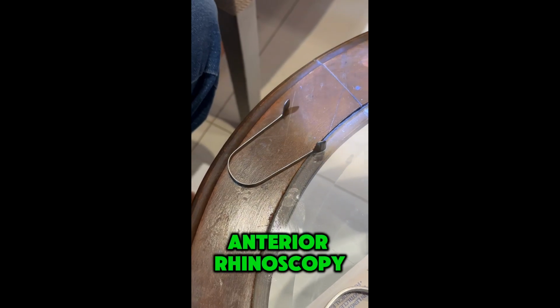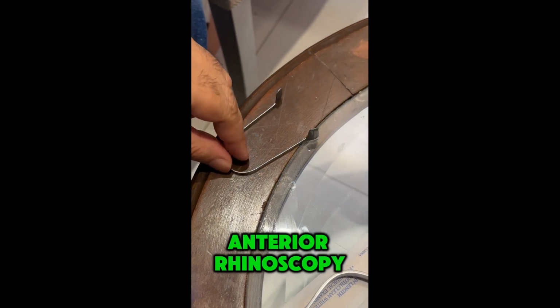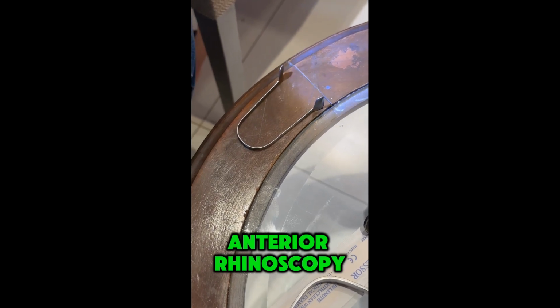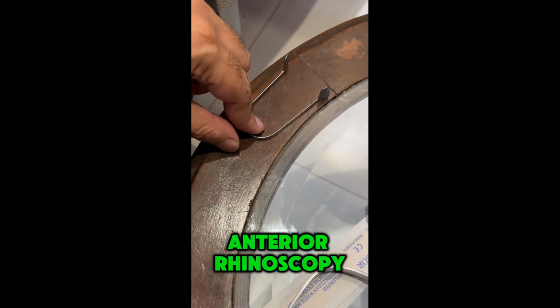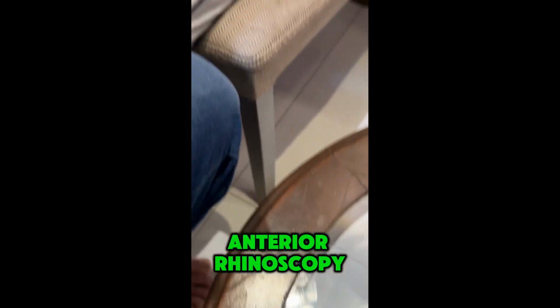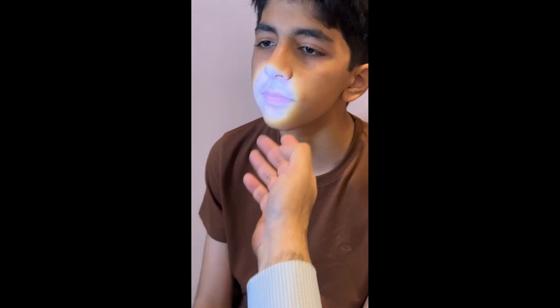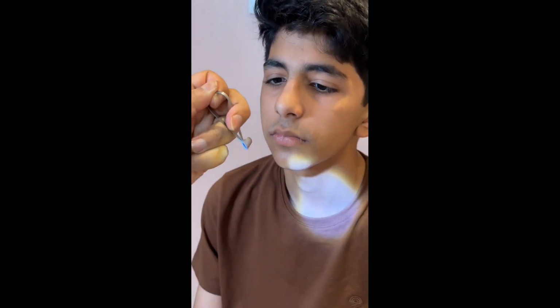Now we will perform the anterior rhinoscopy. So this is the Thudicum speculum. We place the Thudicum speculum on the table with prongs facing upwards. Put our index finger and hold with the thumb and take our middle finger around. Now we have to insert it like a triangle and we have to visualize from this area.